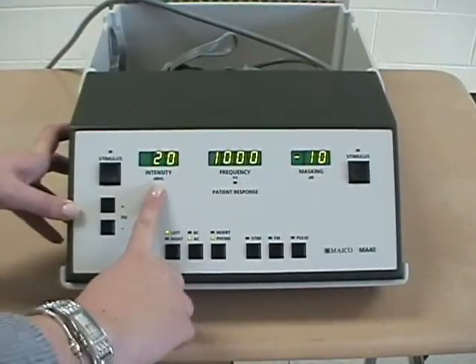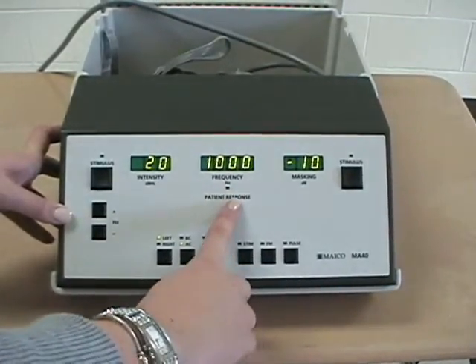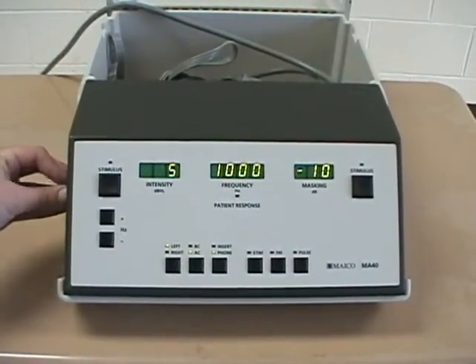The intensity number is the loudness or the softness of the pure tone being presented. This number is the frequency, which is presented in hertz. And this is the masking number in decibels. This knob right here changes the intensity.